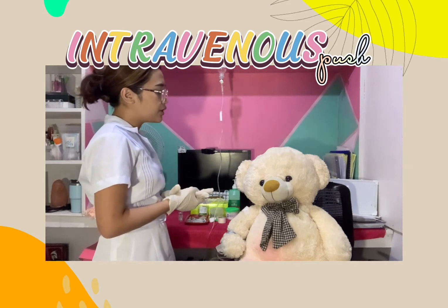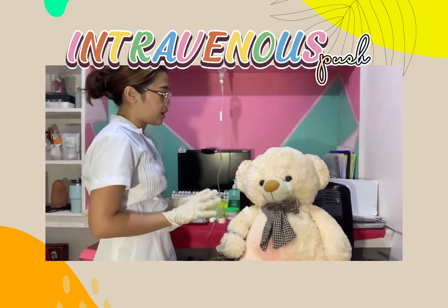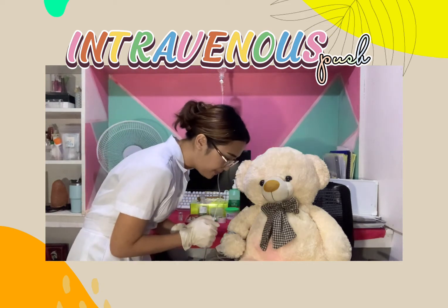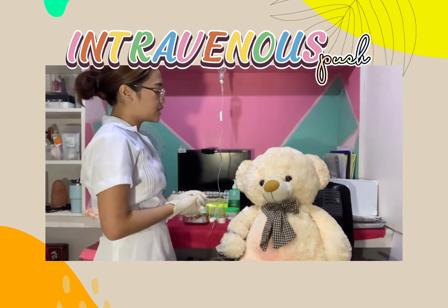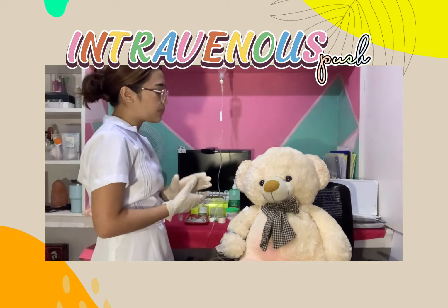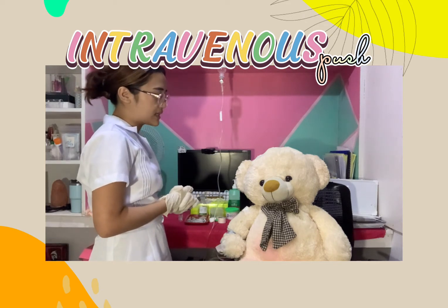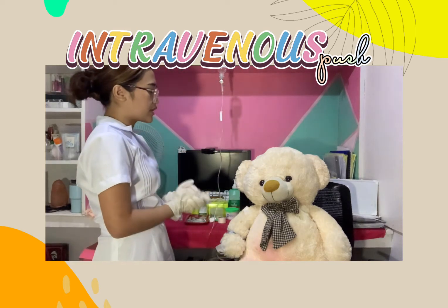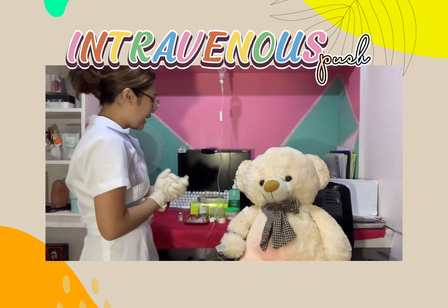Also po, ma'am, you can cooperate po by relaxing your hands po as we perform the procedure. Is that okay with you po? Also po, ma'am, we will administer the paracetamol po as per order po of your doctor. Is that okay with you po? Okay po. So, now we can start po by the IV lock.